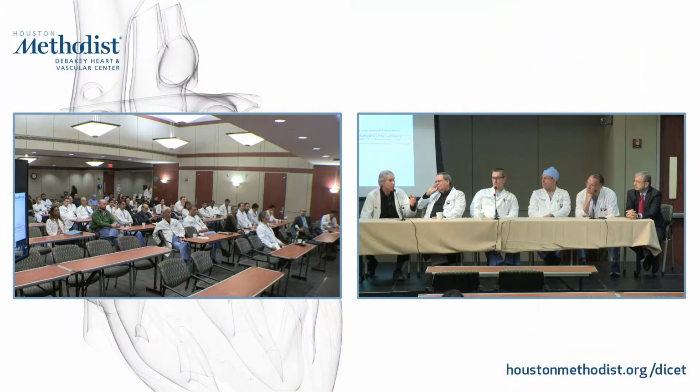If you have somewhere between 90 and 145 Hounsfield units, that's more consistent with an older thrombus or an organized thrombus, which may or may not be really responsive to anticoagulation therapy. And anything over 145 is considered to be pannus. Not only can you use the Hounsfield units to better describe what this might be, but also in terms of looking at how obstructive the area is and the extent of it.